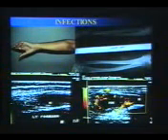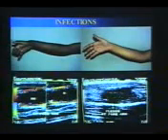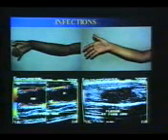And then we found that there is a big abscess seen over here, and this color flow shows the hyperemia and necrosis, and this turned out to be atypical tuberculosis of the forearm muscles. The patient clinically presented as VIC. Same patient, you can see they presented as VIC here, fullness here, bones were fine. Again you can see the ulnar contracture, deviation, and the fullness here, and all these other abscesses. This is the cortex of the ulna, and this is the muscle abscess you can see here, and this is the abscess, again atypical tuberculosis.